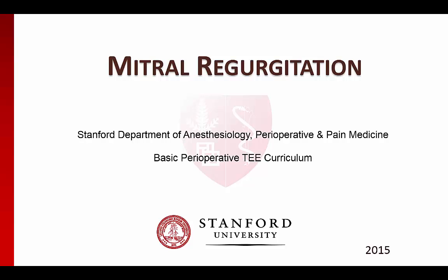In this lecture, we will discuss the causes and echo evaluation of mitral regurgitation. Before watching this lecture, you should have already watched and become comfortable with the normal valve anatomy lecture.